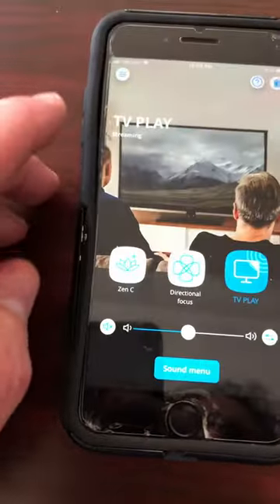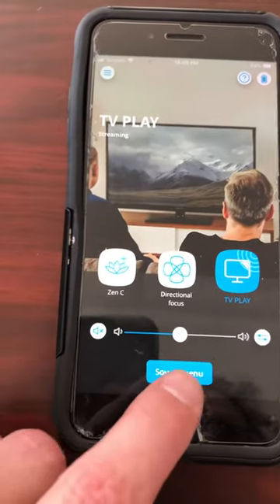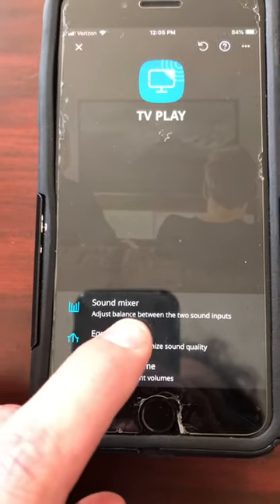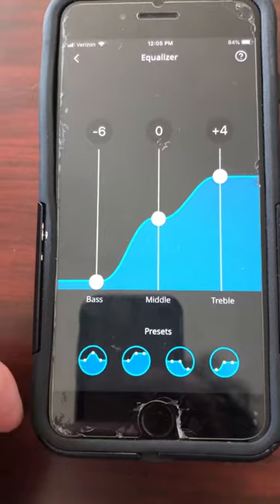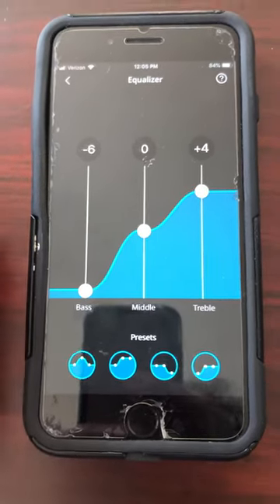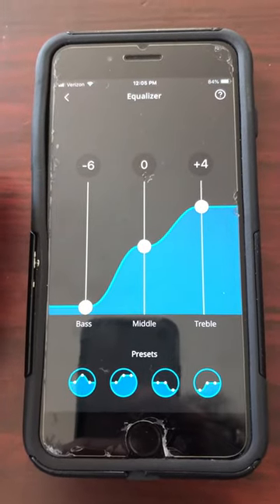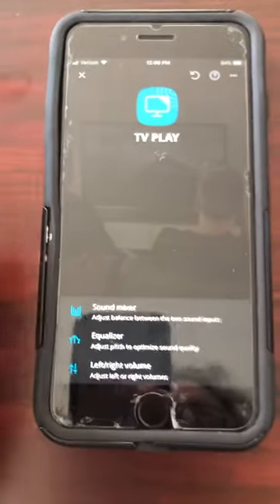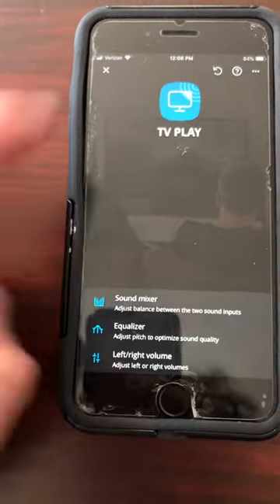The other thing you will find very useful when using the TV Play is making adjustments to the sound quality if necessary, and that's accomplished by using the equalizer. My preference happens to be no bass and a little bit of extra treble — you're going to figure out what works best for you. In order to get the sound you're looking for, this is the menu you'll want to access, right here from the equalizer after you've logged into the TV Play.